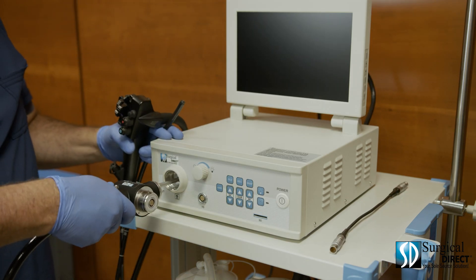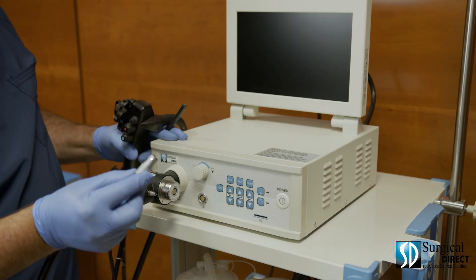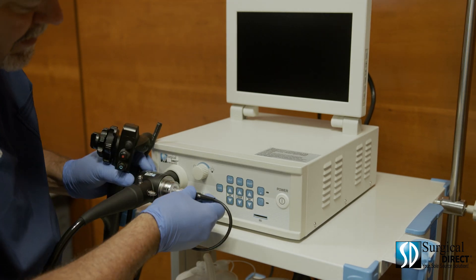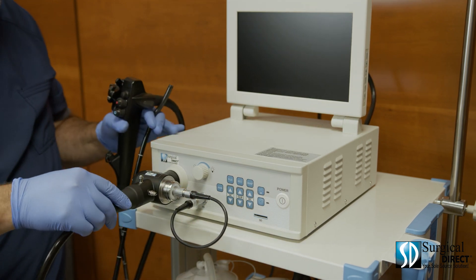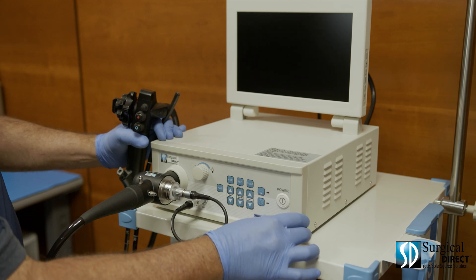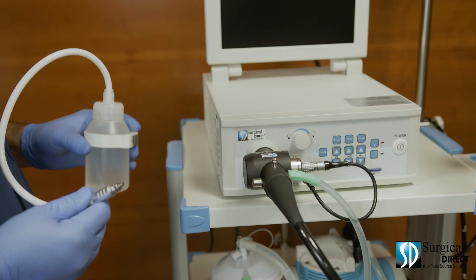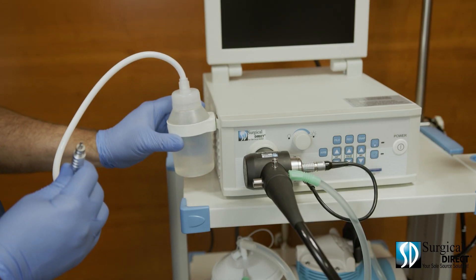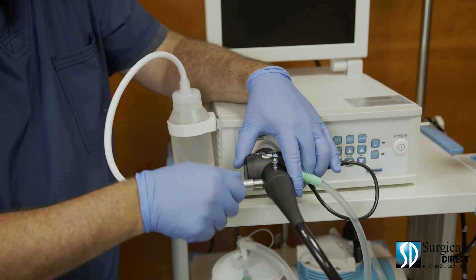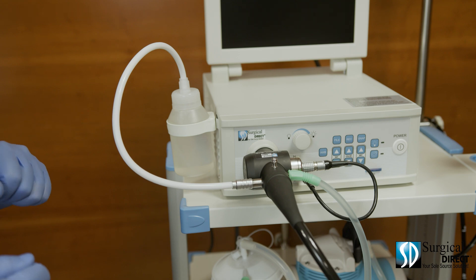Attach the video hub to the processor. Be sure to hear the click. Then attach the video signal cable with the red dot up to the processor, and again with the red dot up to the video hub. Next, insert the SD card into the unit. Attach suction to the Christmas tree adapter. Fill the water bottle three quarters full with water, hang it on the side of the processor, and attach the other end to the water port on the scope. Be sure it's properly seated or you will have a leak and will not have enough air pressure to perform your procedure.